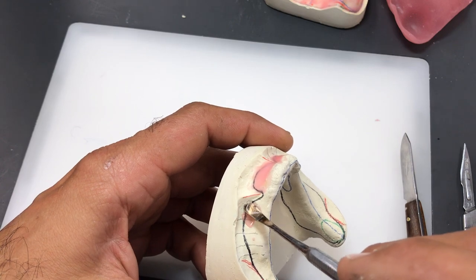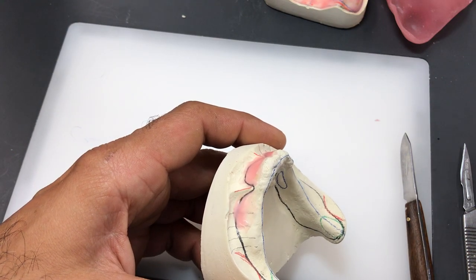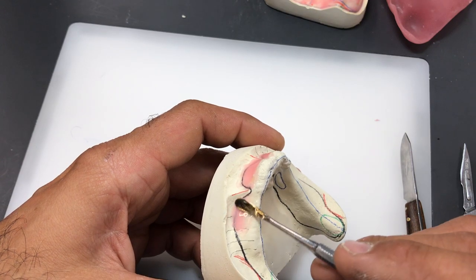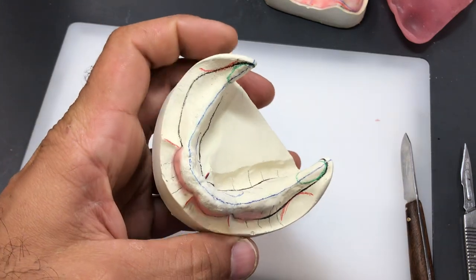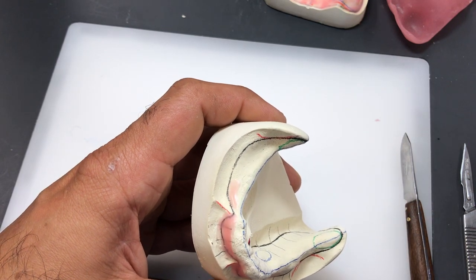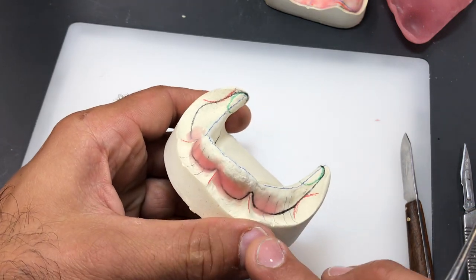Now, because we're using the wax spacer on the lower, my block out doesn't have to be as much as I did on the upper. I could be a little bit thinner. Because I'm going to use a wax spacer, that wax spacer gives me a lot of forgiveness. But certainly, you need to block out the visible undercuts. Those were very minor undercuts.